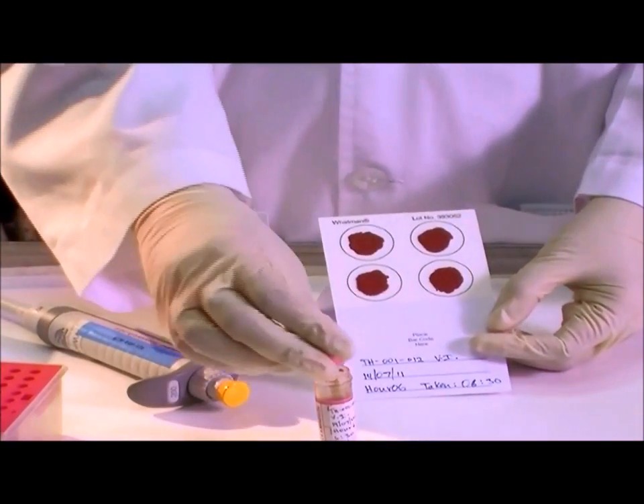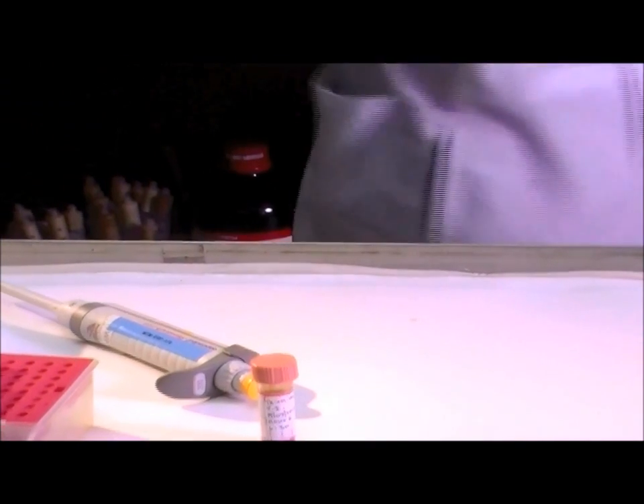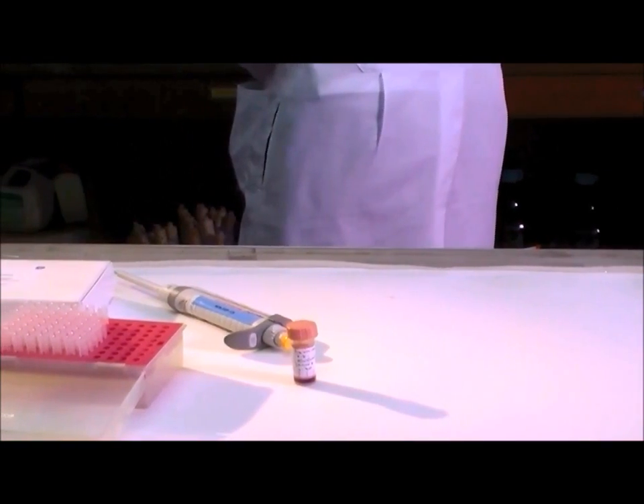Suspend the card at room temperature for at least six hours to dry. Cards may be dried overnight. Do not apply heat to dry.